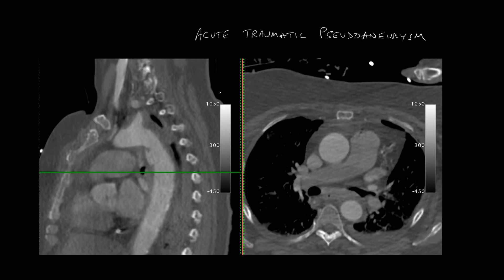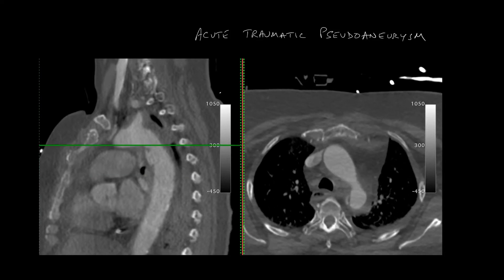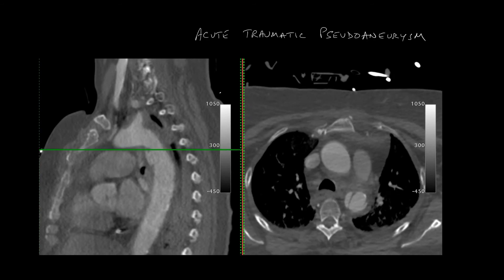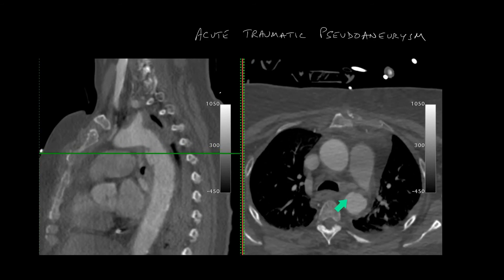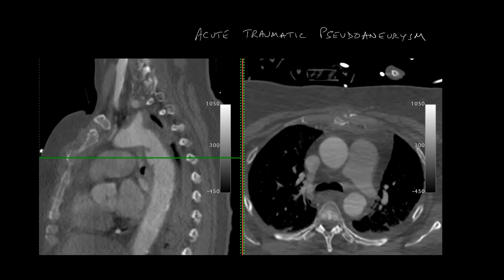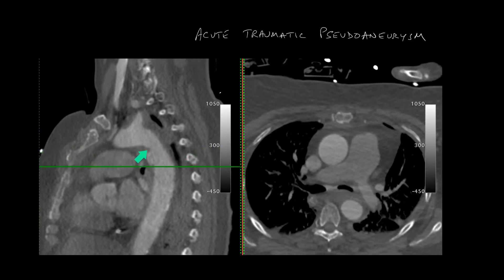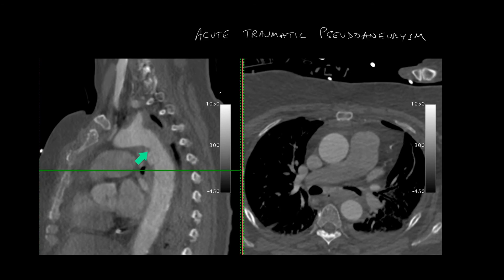In this patient they also have a pseudoaneurysm, and you can see that it is arising from the inferior aspect of the aortic arch. Note also the mediastinal hematoma.